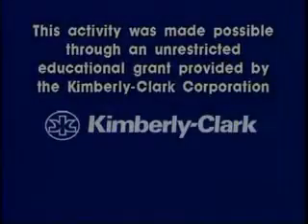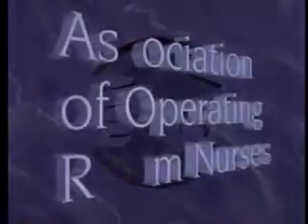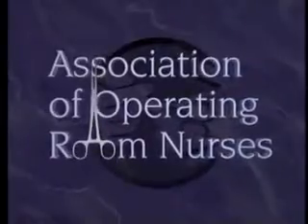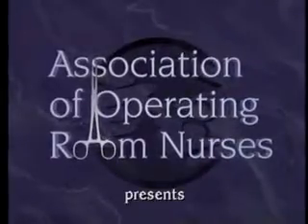Laser applications and safety practices place increasing demands on the perioperative nurse and team members as they implement the intraoperative phase of patient care. The Association of Operating Room Nurses is therefore pleased to present this continuing educational activity entitled Lasers in the Operating Room.